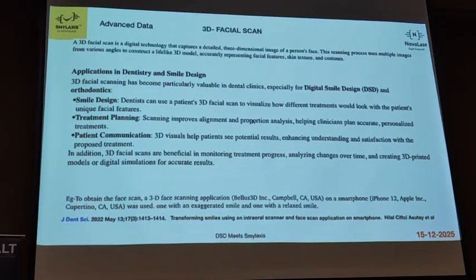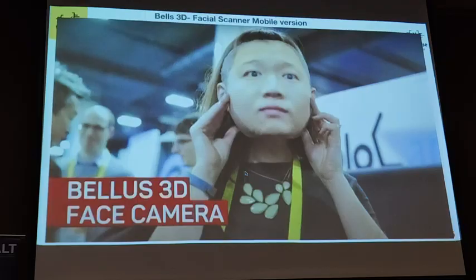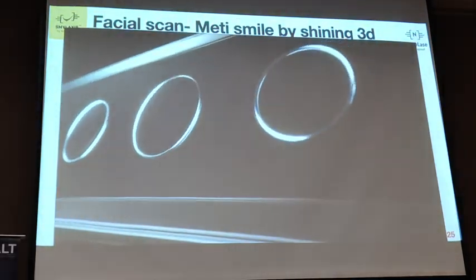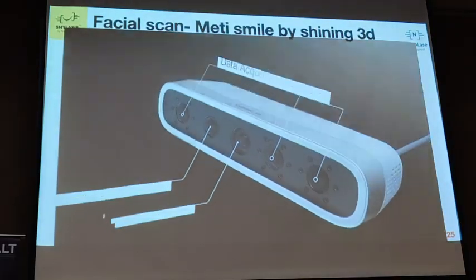3D facial scan. You can use this free software on your mobile that is called Bellus 3D. It does 3D, I think on iPhone. But the thing here is, when you export the file, they ask you money. For making the image, it is free. When you try to send it to someone else, there is a toll gate there. They ask you money. Otherwise, we have Metismile by Shining 3D, a very good one.